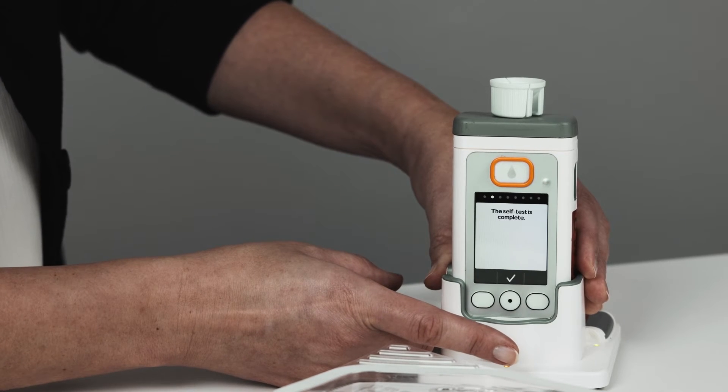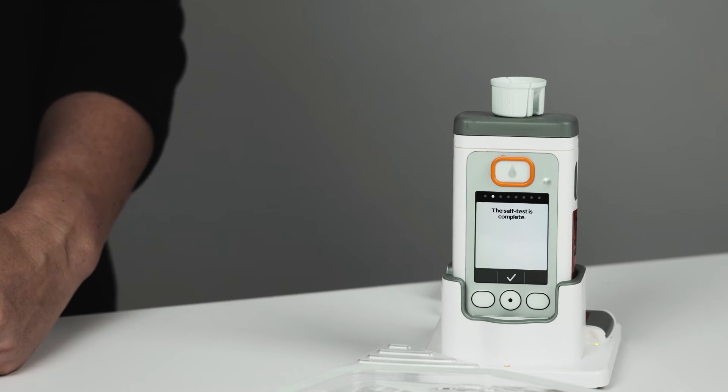Next, the pump will run a self-test to ensure that everything works properly, which takes approximately one to two seconds. If the self-test fails, you will see a red light. Restart the pump by removing the battery and start the procedure again.